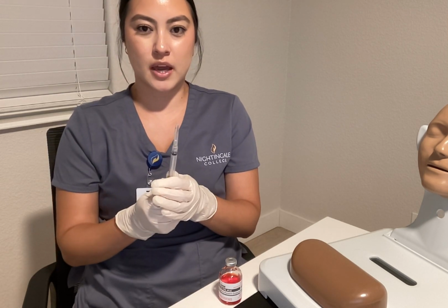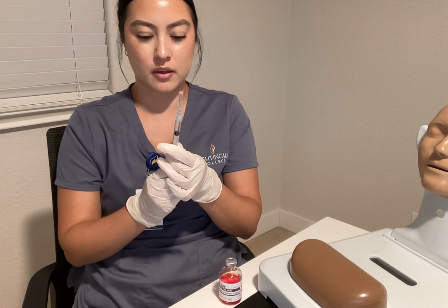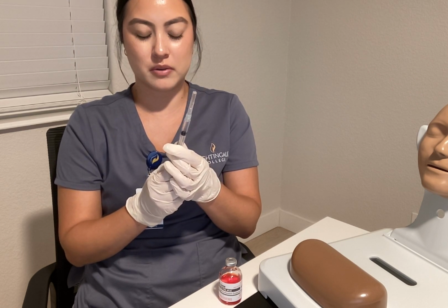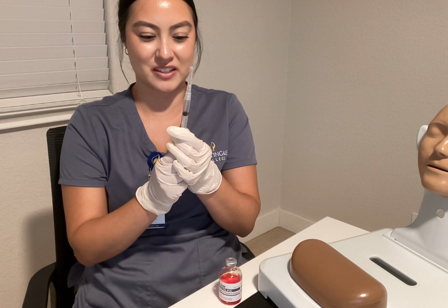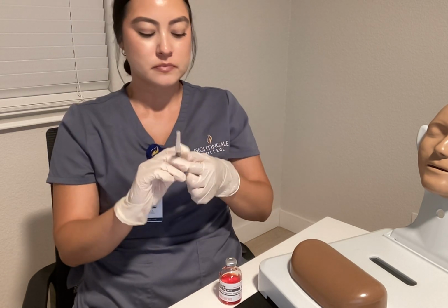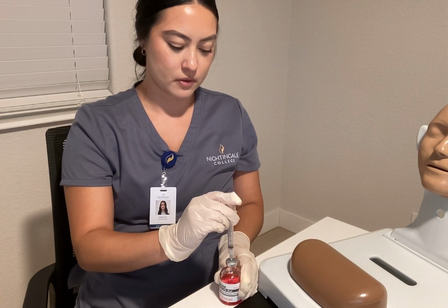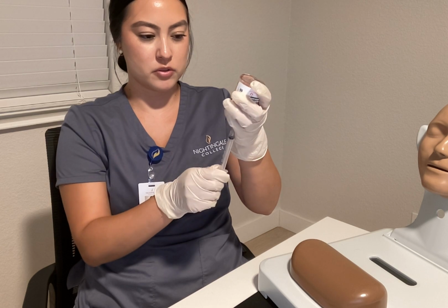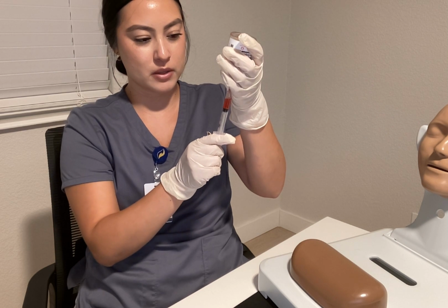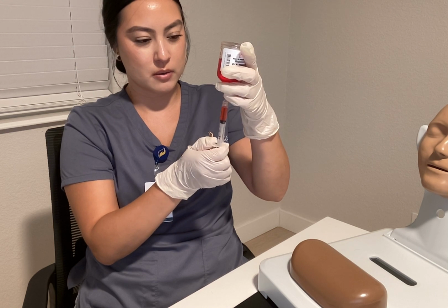We are going to inject air into our vial first. We're going to draw back and just inject in air. So we are drawing back 1.5 of air, and we're going to inject this into our vial. And we're going to invert, and we're going to draw out the medication morphine, which is 1.5 milliliters. And if there are any air bubbles, we just inject back a little bit.